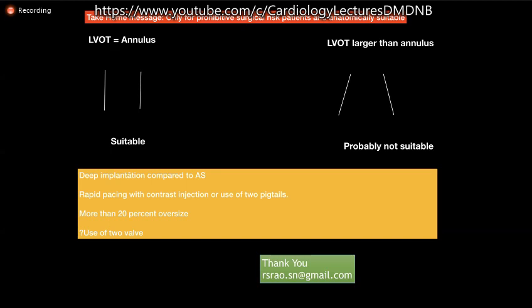But if the patient has prohibitive risk, there are multiple ways to attempt. You put one valve and then you put another valve inside it. So, deep implantation compared to aortic stenosis. Deep doesn't mean it's like deep, deep. It's just a relative term in relation to the valve when you implant it in aortic stenosis.